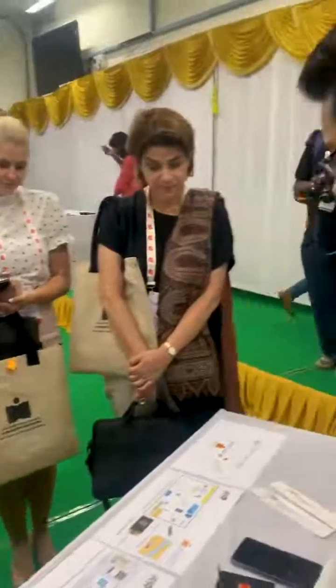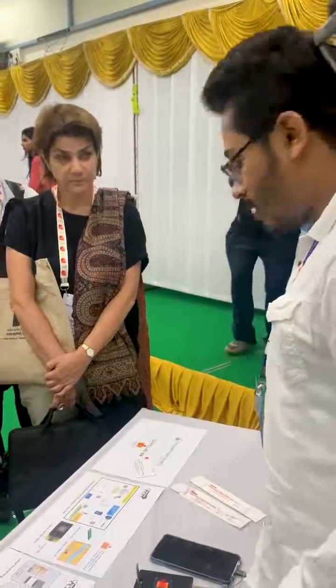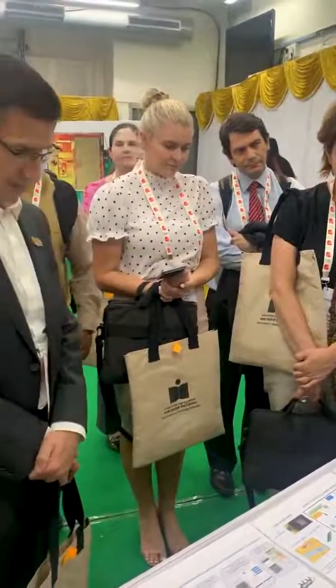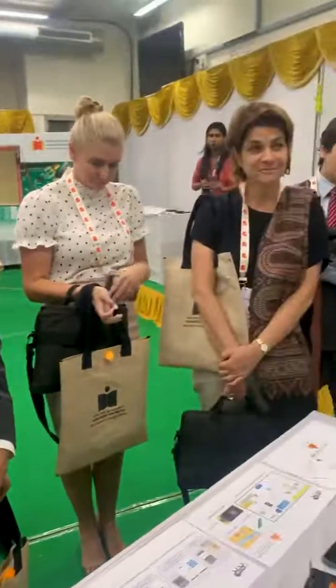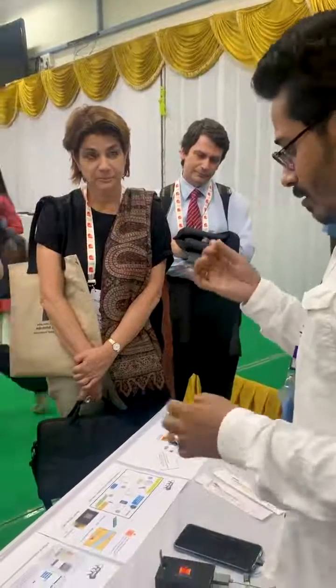So here, whatever the speakers told, we are going to give a live demo of the test kit. Basically, these are all the things we need for testing of the device. This is just for sample collection. You can take the nasopharyngeal swab or throat swab, and this is for corona.